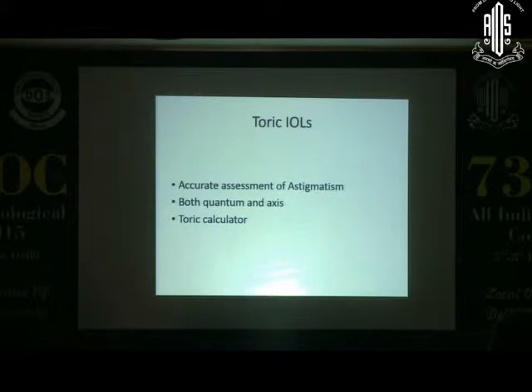If you look at these two plus and minus marks, one of the two is smaller, the other one is bigger. The same applies to the minus mark also. So when you align the plus, it's much easier to align. So now focus, get the plus in line, turn the drum till the plus gets perfectly aligned. Take the reading. That's going to be K1. Now turn your whole keratometer through 90 degrees, realign again, and get the plus aligned.